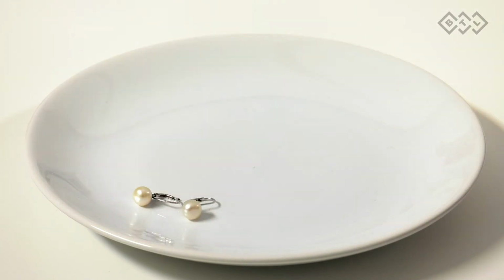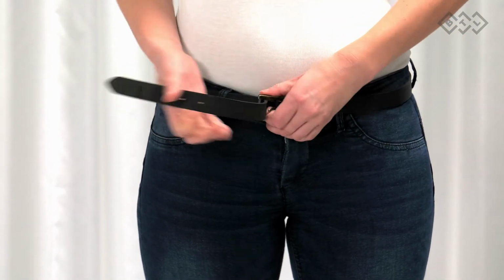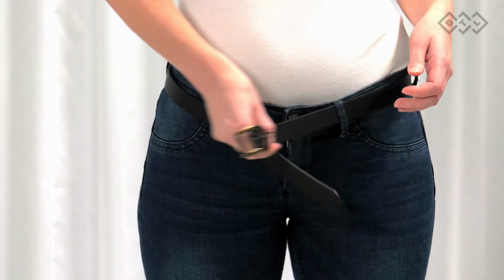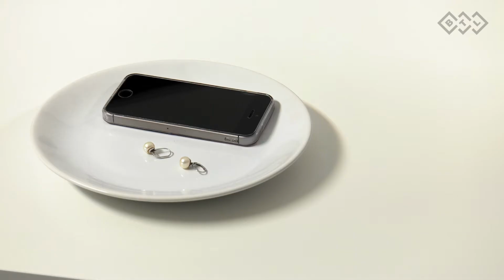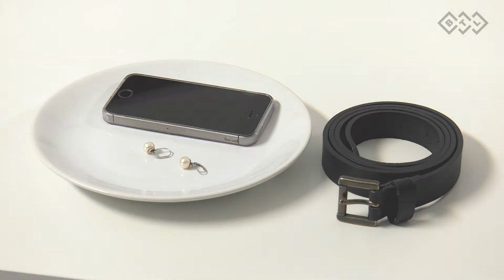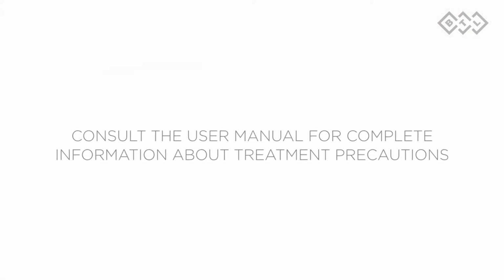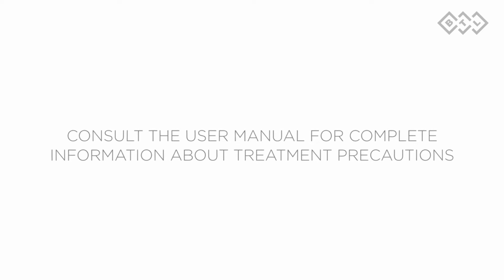Ask the patient to remove all jewelry and any metallic accessories, including piercing, before treatment. The patient should also avoid wearing any clothing with metallic parts, such as zippers, bra wires, etc. Do not place any metallic item, as well as any electronic devices, cell phones, data carriers, credit cards, etc., close to the applicator. Consult the user manual for complete information about treatment precautions.